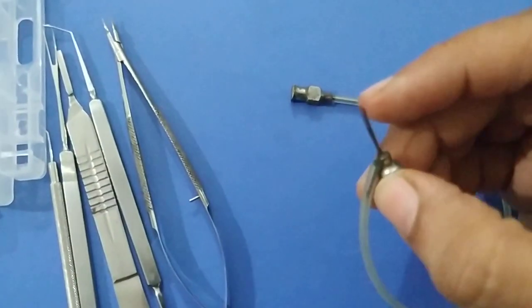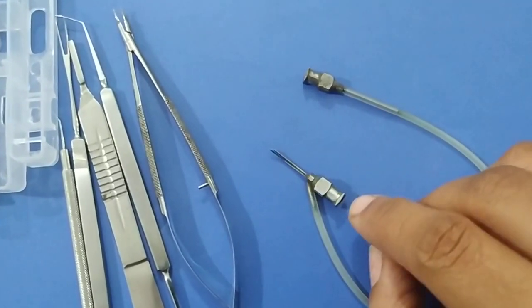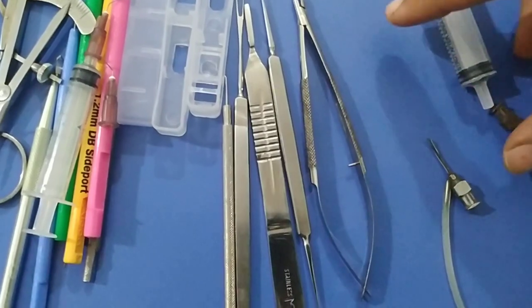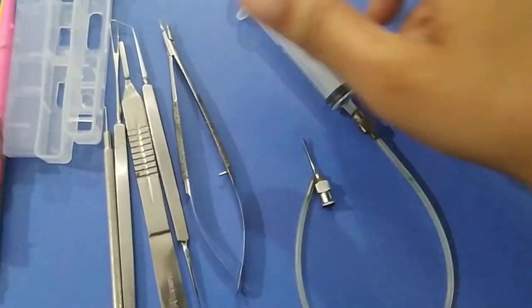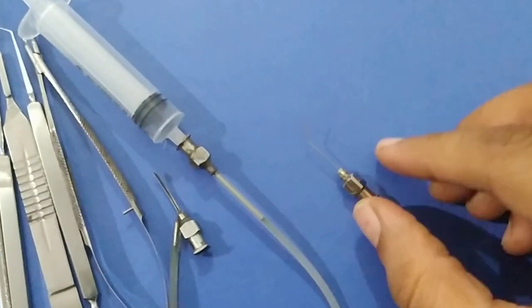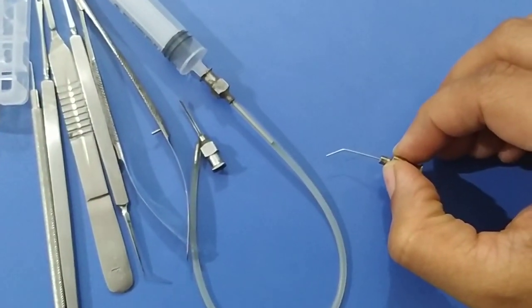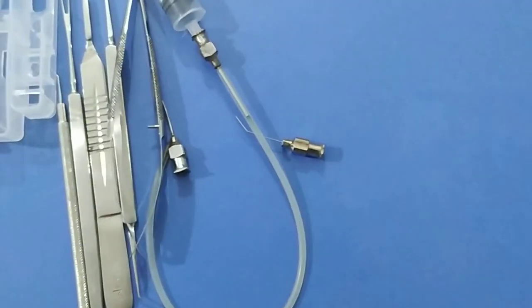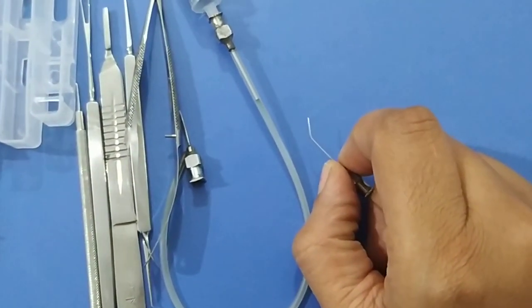This is Simcoe's two-way irrigation aspiration cannula. It has two ports: the straight port is for aspiration and the curved port is for irrigation — we apply the IV set at the irrigation end and a 5cc or 10cc syringe at the aspiration end. This is a hydrodissection cannula. It is used for hydrodissection as well as hydrodelineation. Hydrodissection is separation of the cortex from the capsule, and hydrodelineation is separation of the nucleus from the cortical material. It can also be used for stromal hydration at the end of surgery.